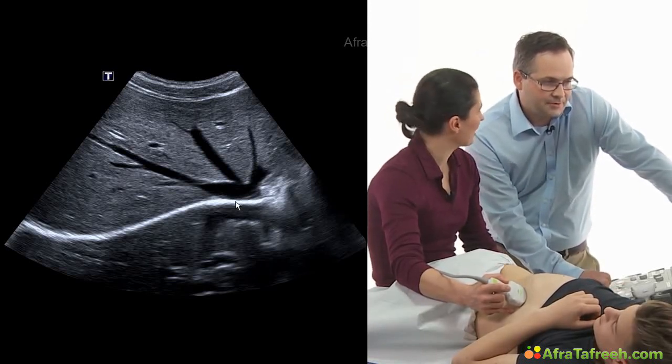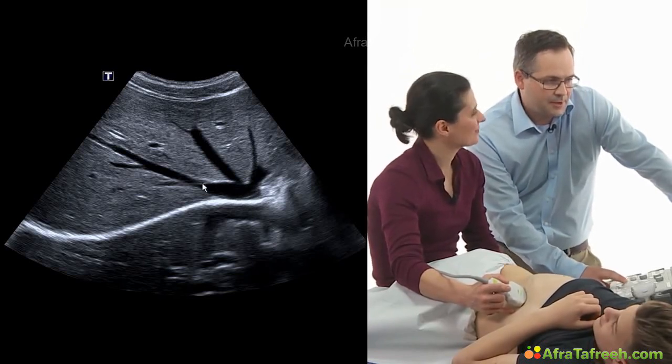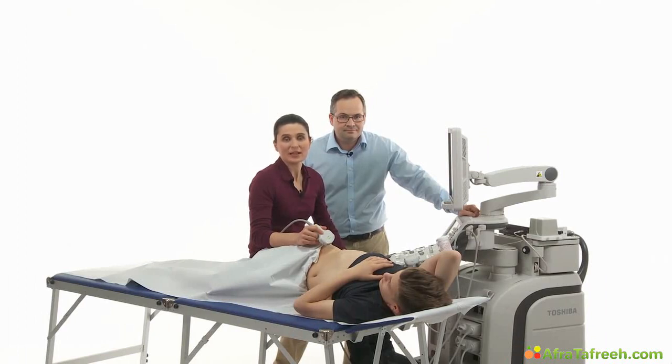Somehow it looks a little bit like a bunny to me. Yes, you are correct. Some say it looks like a star, the star of the liver veins, but it's a bunny. And actually, the more it looks like a bunny, the higher the likelihood for liver congestion. But this we will discuss in our chapter of liver pathologies.